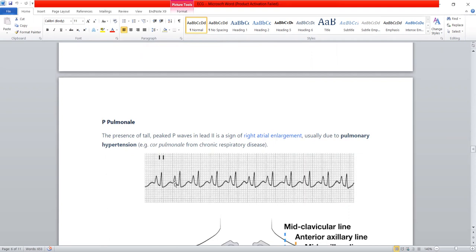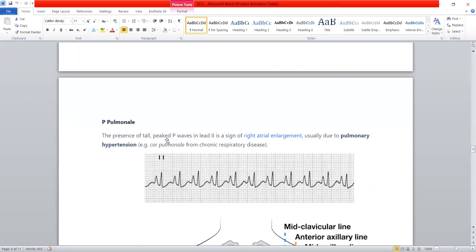On ECG, if you see a P wave before the QRS complex with a high amplitude or high voltage — tall or peaked — this is P pulmonale. It is due to right atrial enlargement or right atrial hypertrophy. If there is right atrial enlargement, you will see P pulmonale on ECG.